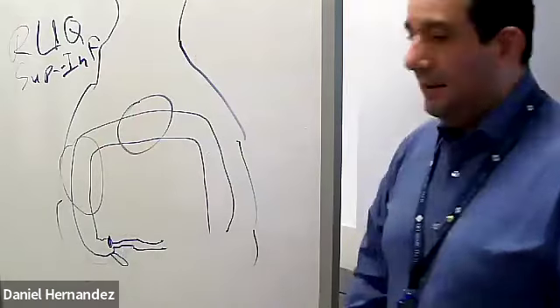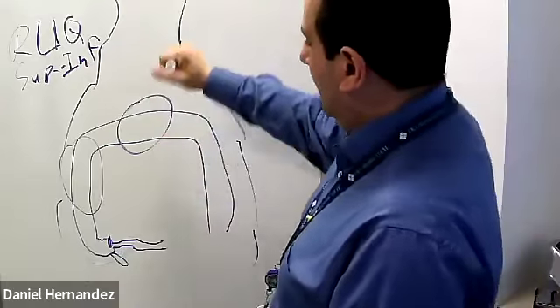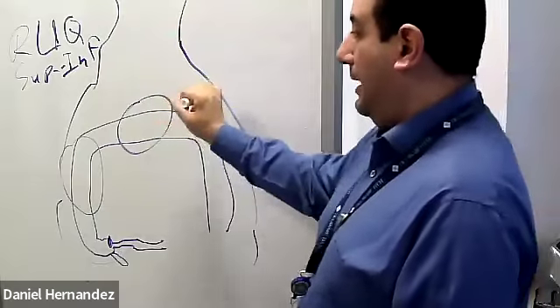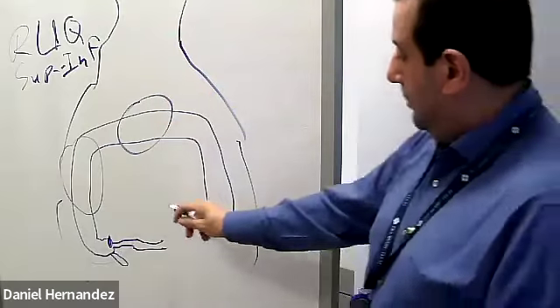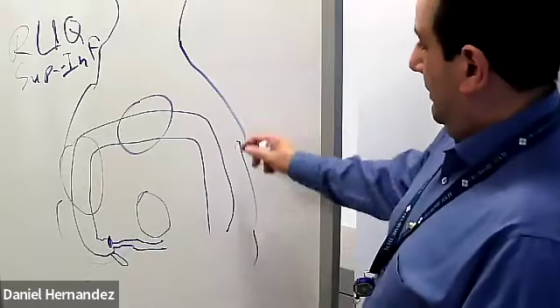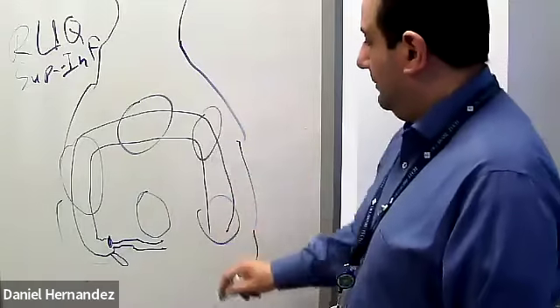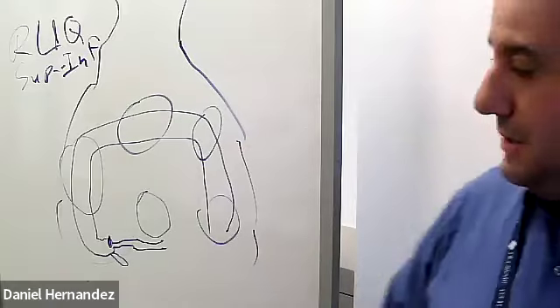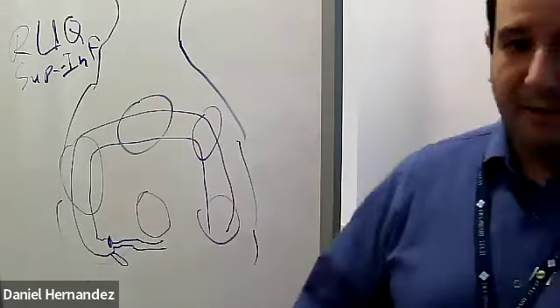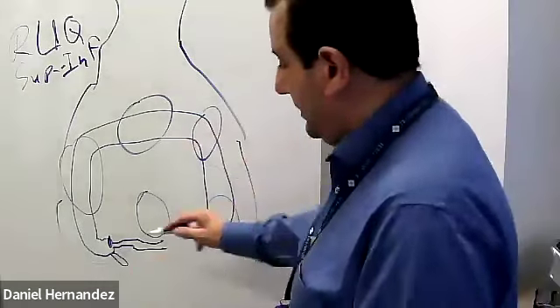Then we're assessing the large intestine at midline. We do midline upper: a couple of static images and then a sweep, superior to inferior, right to left since we're midline. Then we move to midline lower, and then left lower, left upper, or left upper, left lower. It doesn't really matter, you just continue. So basically you're doing six quadrants, or six areas, within the abdomen. Same thing, sweeps and a couple of static images, and you're assessing the entirety of the large intestine.